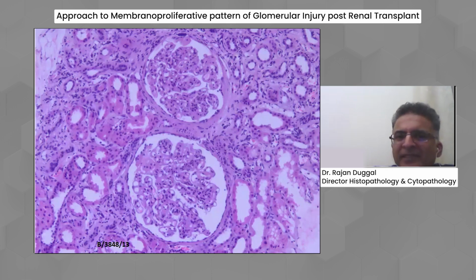You can even write in the chat box. Okay. Yes, this is a hematoxylin and eosin stain that I'm showing you.